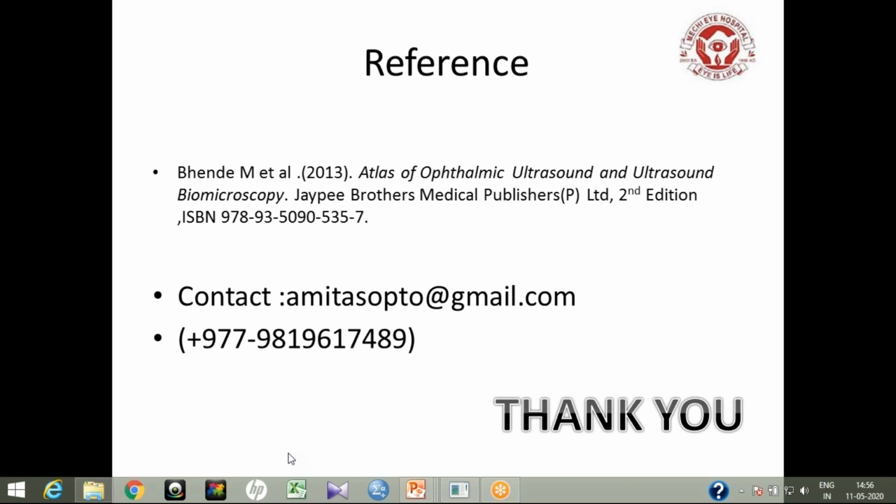Sorry. Can you repeat the question? Yes, sir. Is there any difference if we sweep the probes over the sclera or over the eyelid?